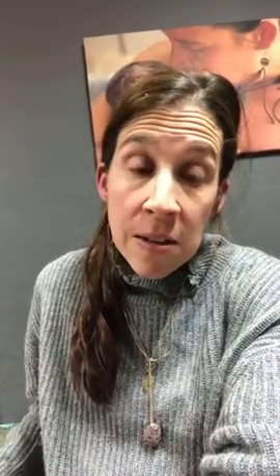And once you identify it, that's great. Then you'll just want to listen around in that area even further. Listen a little to the left, listen a little to the right, a little up, a little down, and just notice how the sound changes. And then you can become really great at identifying that point of maximum intensity.